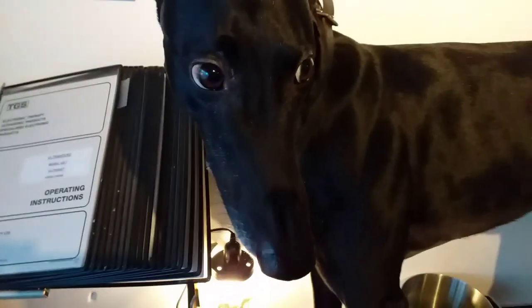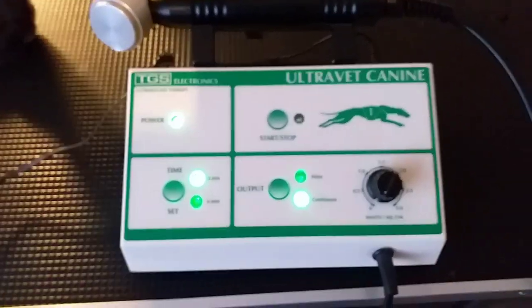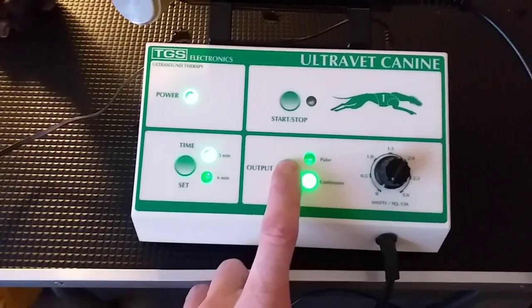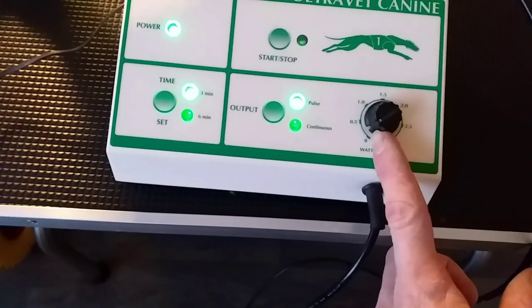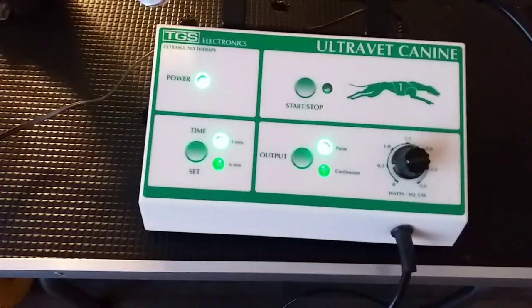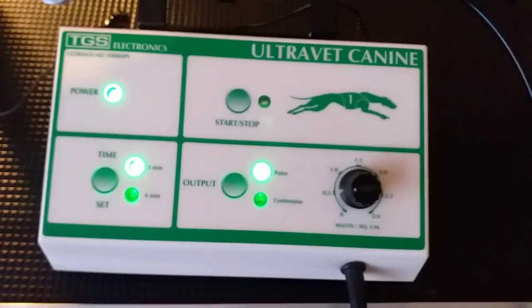We've got Nero here strapped into the treatment table. The dog pretty much becomes stable standing there if he feels that he's tied to something. Now we're going to treat him. For this treatment I'm going to choose three minutes. It's just a how-to so I don't need anything more than that. Instead of continuous, I'm going to choose pulse — it's a little bit safer and pulse is overall better if you don't treat a major injury. So I'm going to put the power on one watt per square centimeter.